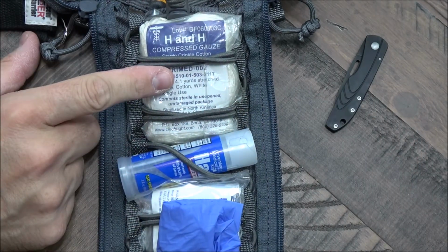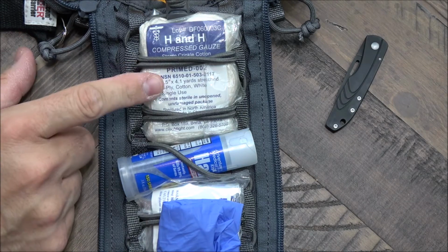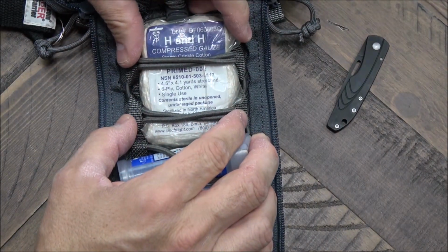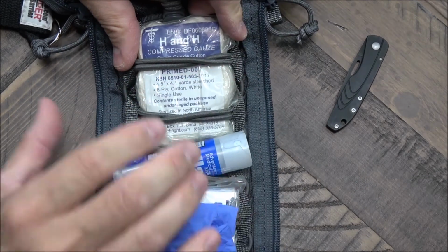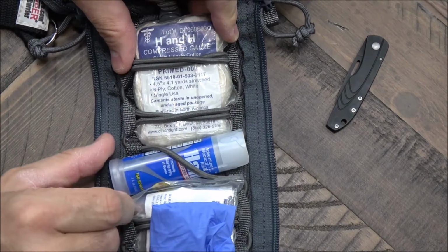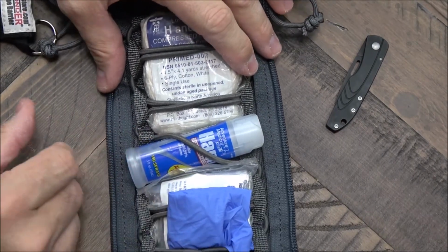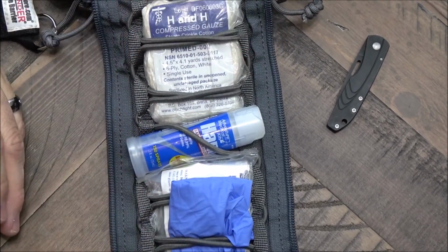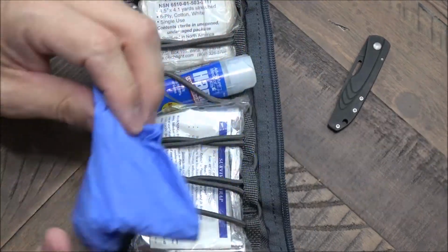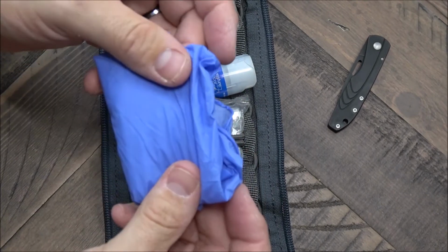I've got some compressed H&H gauze, which is really great for packing wounds, and it's a very small kit because it's vacuum sealed. So once you break the seal on this thing, it really opens up. I've got some hand sanitizer that I keep in here specifically to clean my hands before and after treating a patient. Down below, I've got a pair of gloves.